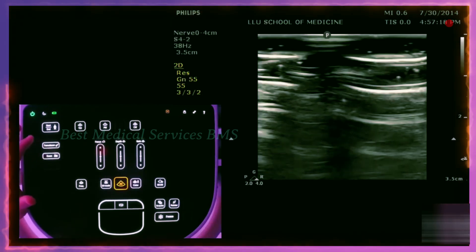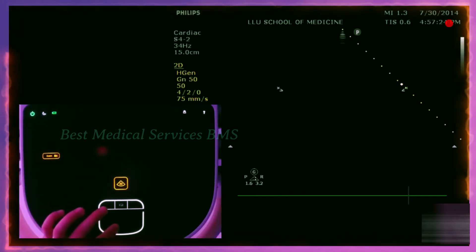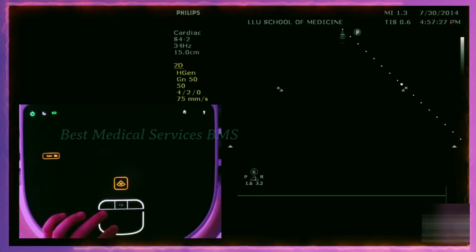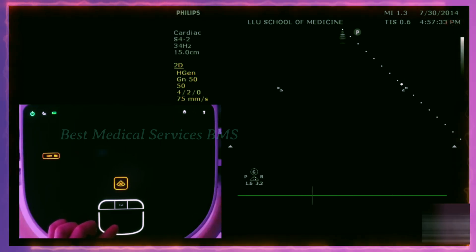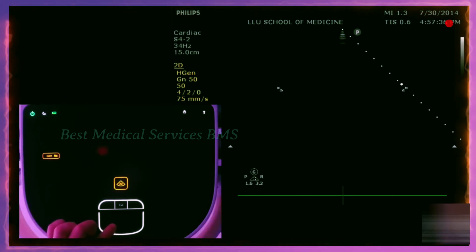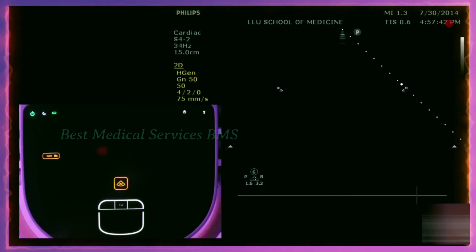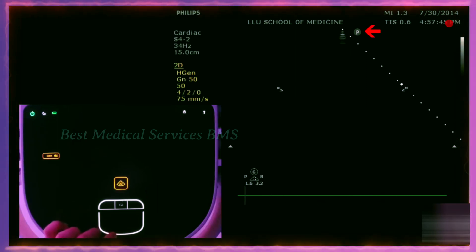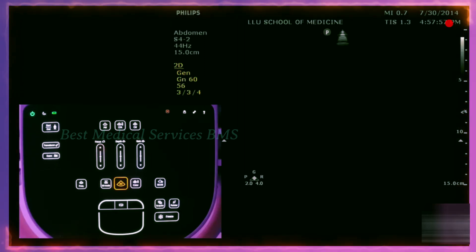If we switch back to the phased array probe and go to exam, you can see there's abdominal, cardiac, pelvic, fast scan mode, lung, and additional ones too. The main ones you're going to use are probably abdominal, cardiac, and pelvic. By default, this machine goes on to cardiac, and the indicator is on the right side of the screen — that's only for cardiac. If we switch to abdominal mode, that indicator switches to the left side. Just make sure you are on the correct mode before you start scanning, or else you won't get your optimal images.